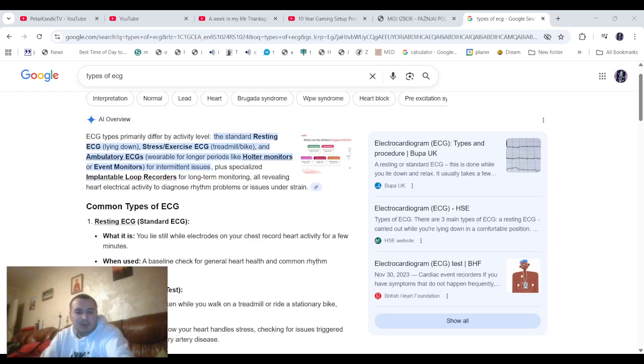Okay, in this video we're going to look at types of ECG. ECG types primarily differ by activity level. The standard resting ECG, lying down; stress exercise ECG, treadmill or bike; and ambulatory ECGs, wearable for longer periods, like Holter monitors or event monitors for intermittent issues, plus specialized implantable loop recorders for long-term monitoring, all revealing heart electrical activity to diagnose rhythm problems or issues under strain.